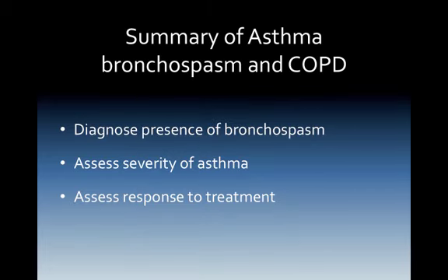Summary of asthma and bronchospasm and COPD. Capnography helps diagnose the presence of bronchospasm. It gives us a nice shark fin appearance instead of a nice flat, elevated plateau. It assesses the severity of the asthma and assesses the response to treatment.